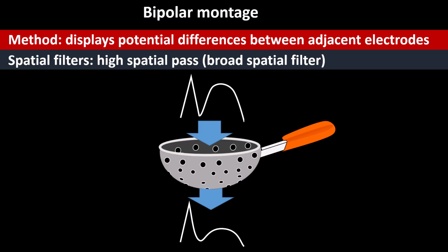On the other hand, the term filter means that it blocks the said component from going through, and therefore that component does not become integrated in the displayed wave. The bottom line is that they filter out EEG potentials with low voltage gradient among the probing electrodes.